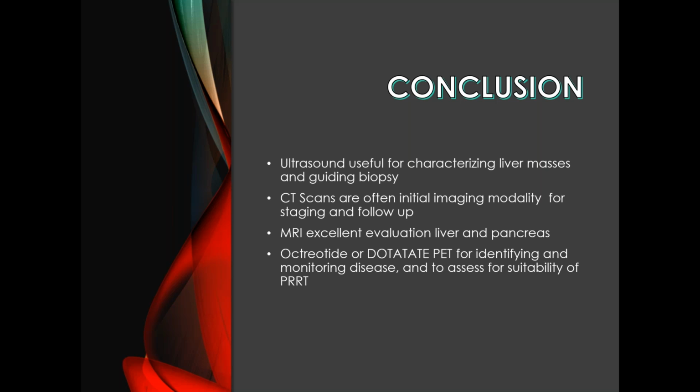That's an excellent question. It's hard to know without reviewing the individual images. Certainly, it helps to go to the same site so that they have the previous studies to compare to. If you go to one site and have your MRI read somewhere else, it could be a bit different. They may not have access to the priors, and so they may not measure it the same way.